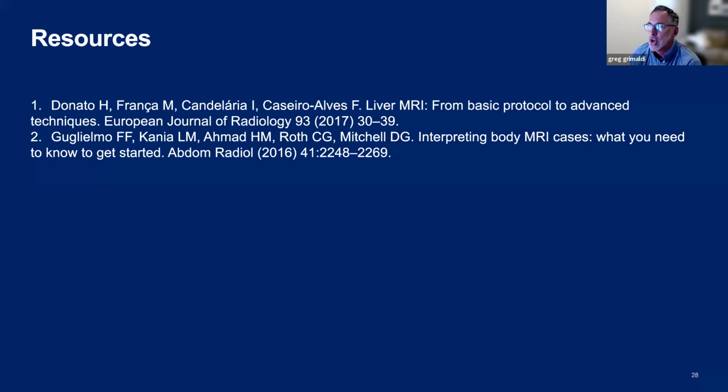And I think if you need to know exactly how many lesions are in the liver and where those lesions are, because it might change your surgical algorithm, EOVIST is very helpful. And using those extra 10 minutes in that hepatobiliary phase contrast can really get you information.